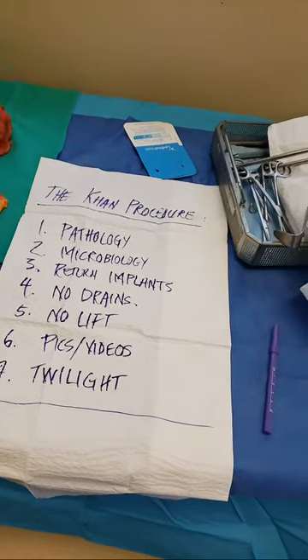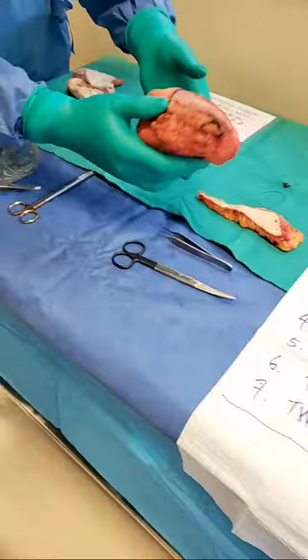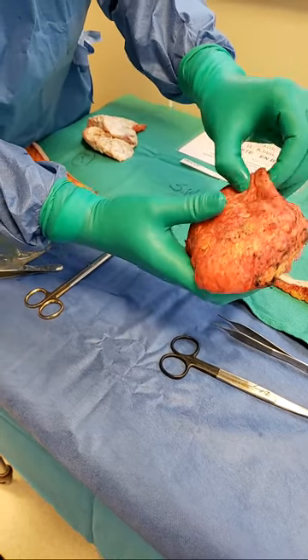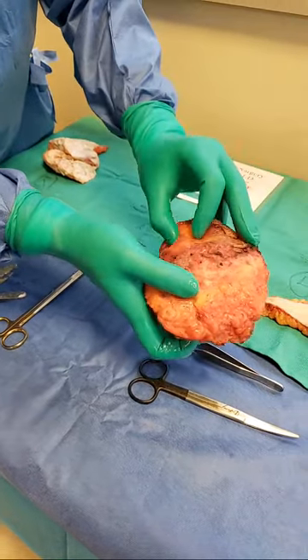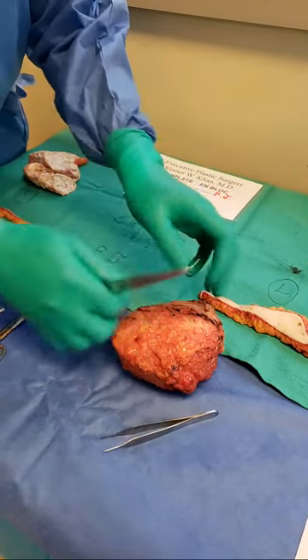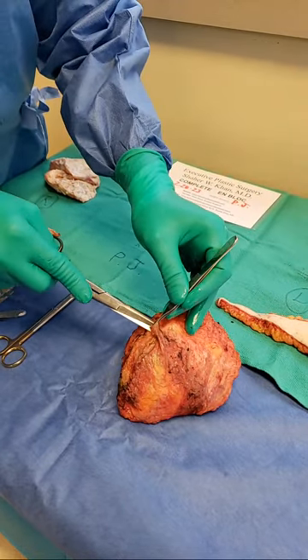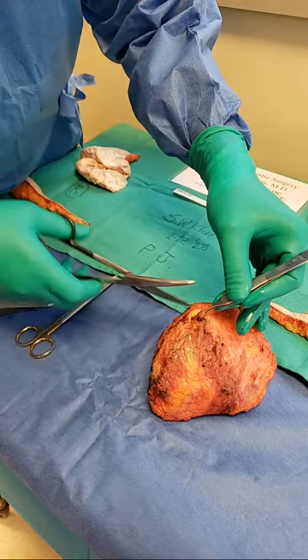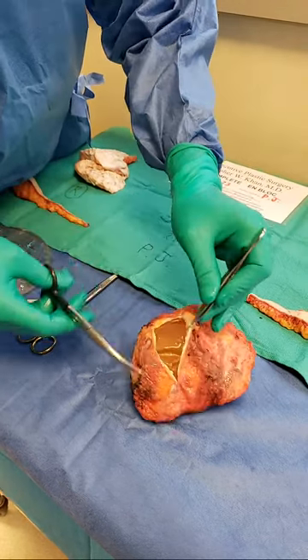I've changed my gloves. Look at this side tissue — this really helps kind of lift the tissue up as well. A lot of inflamed tissue in the periphery. You can see these are like small chunks of fatty tissue, abnormal. Over here carefully, this is an area that's very soft, this area is relatively hard. All contained en bloc — the gold standard. None of this spilled into the chest.